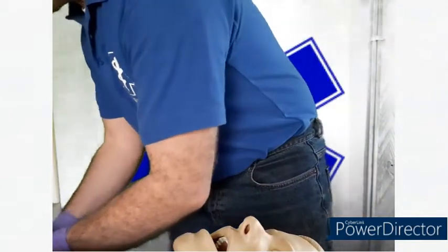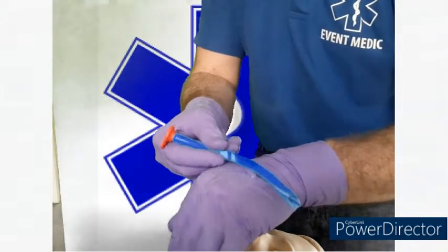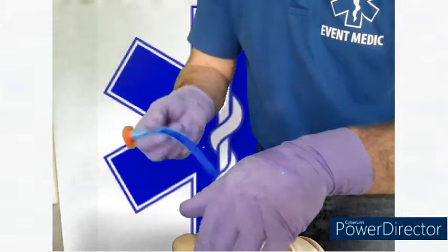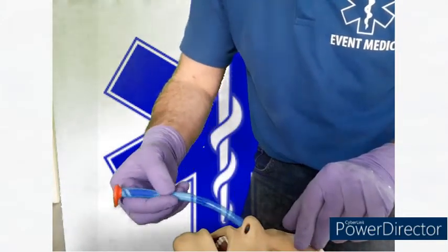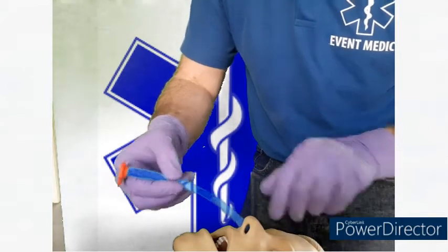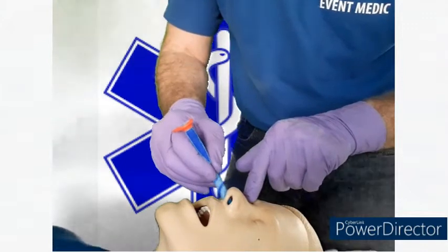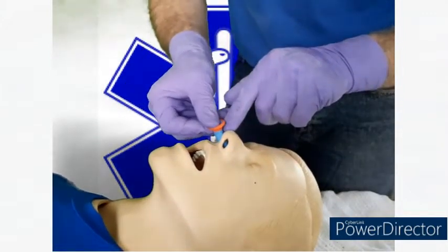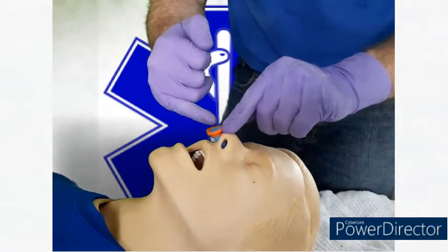So one way you might do it is by putting some lubrication onto the back of your glove, getting some lubrication onto the nasal pharyngeal, introducing it into the right nostril, and then as we go in, we come up to push the nasal pharyngeal down, and it will go all the way. A nice big wide ring on the end stops it going any further.